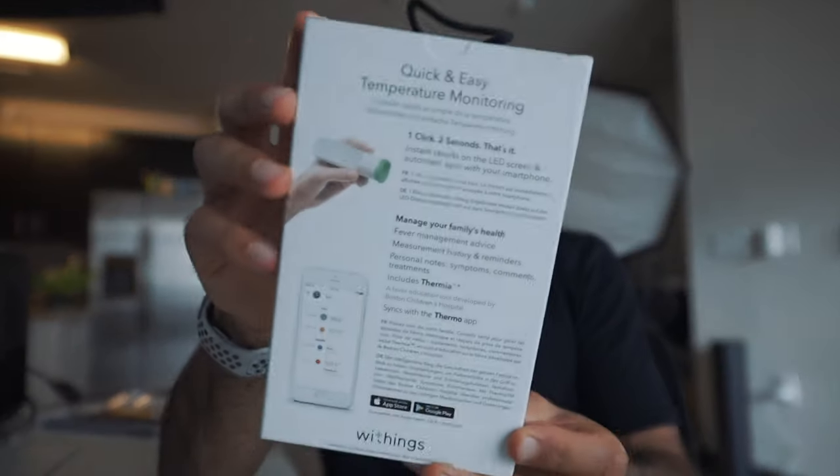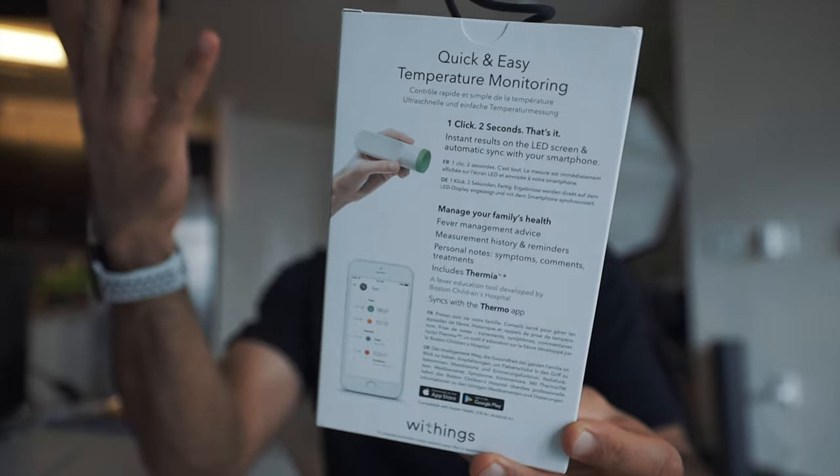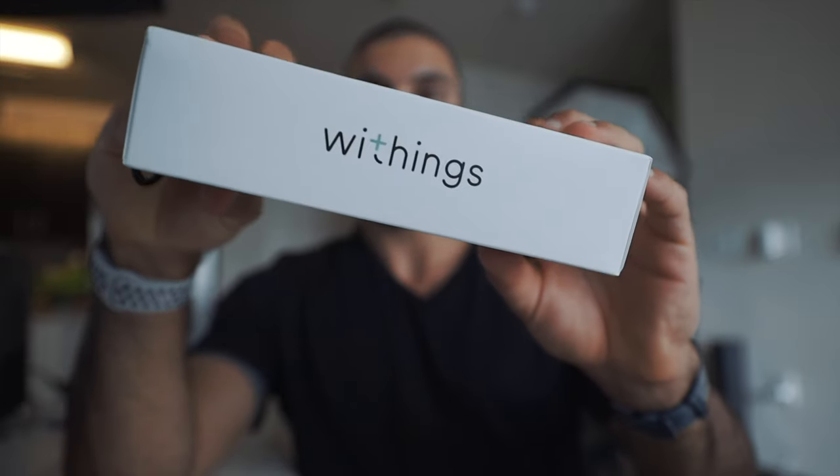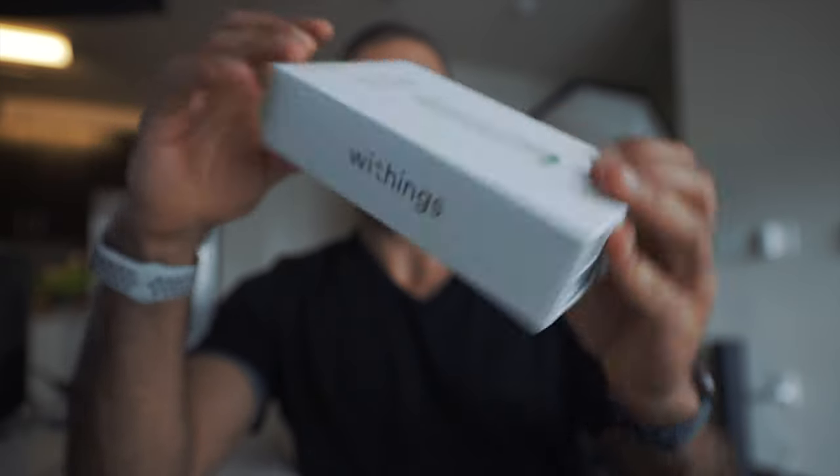Quick and easy temperature monitoring for your family and everything. It's got the app. You can obviously also do babies, and that's how I knew that this is for me. With Withings now — it's not just Nokia. It's just something they keep in mind; they are no longer a company together.